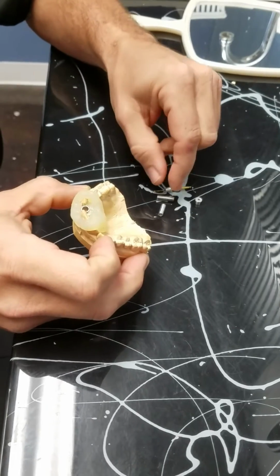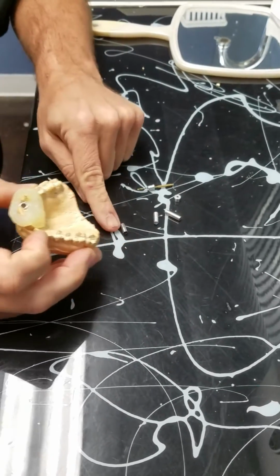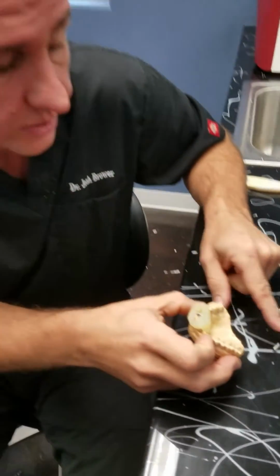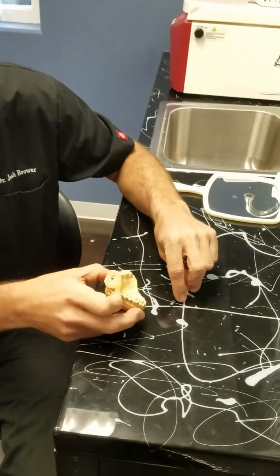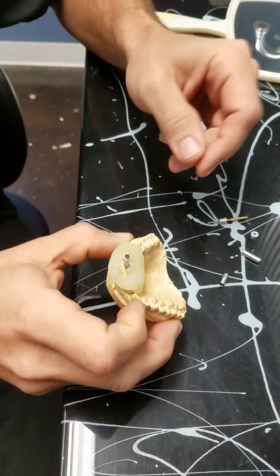After you've got the hole drilled, there's a 15, a 13, and a 10 millimeter bushing. You pick the correct bushing for the size of the implant. So if it's a 15 millimeter bushing, it's a 15 millimeter implant. These are going to go inside, just like that.